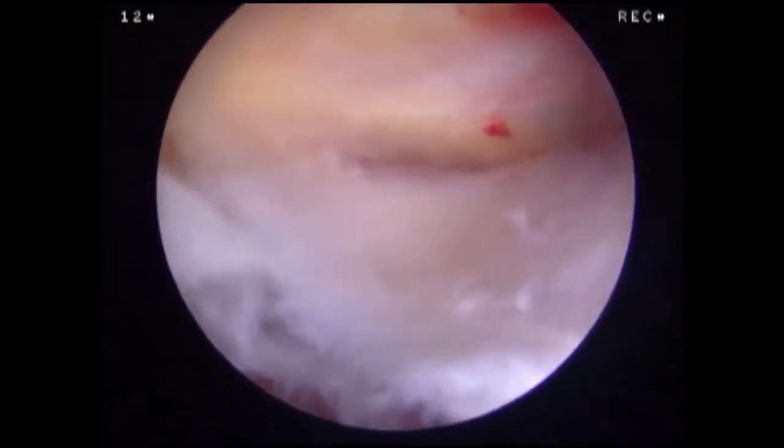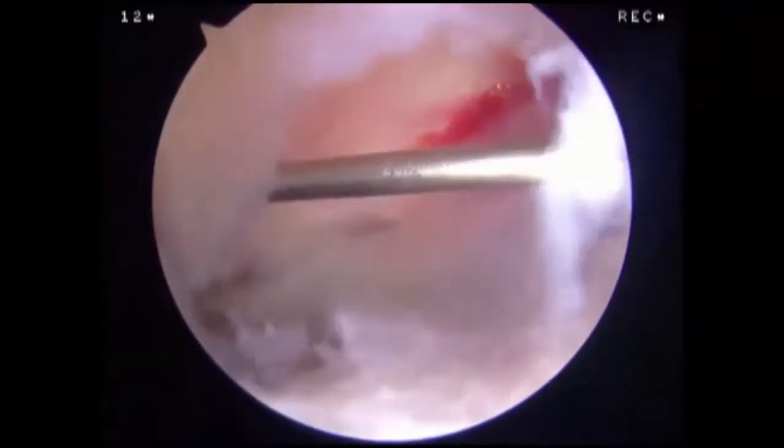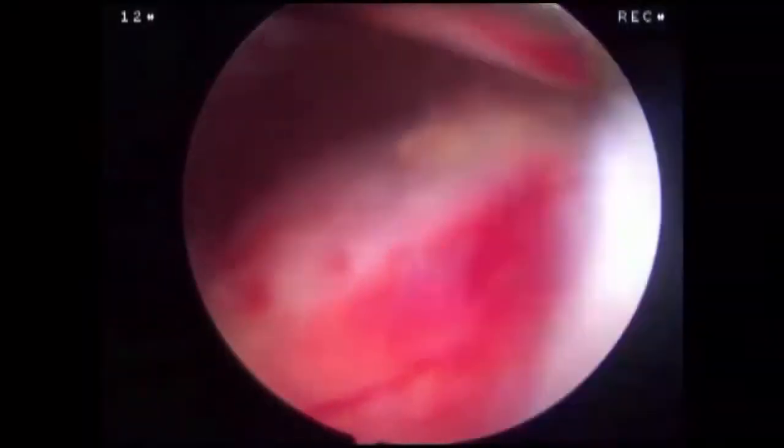This is the subacromial space of a left shoulder in the beach chair position. Inflamed bursal tissue is readily evident on initial examination. The coracoacromial ligament can be seen in the background. A spinal needle is used to create the lateral portal parallel with the undersurface of the acromion. A motorized shaver is introduced and a limited bursectomy is performed. The bursa is removed until the rotator cuff tendons are visualized.